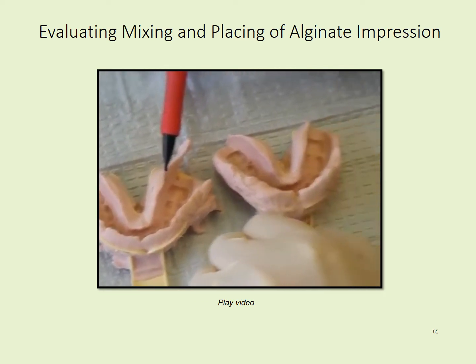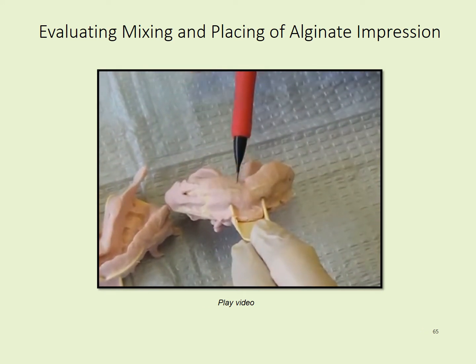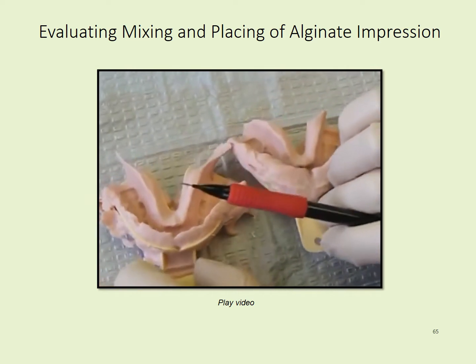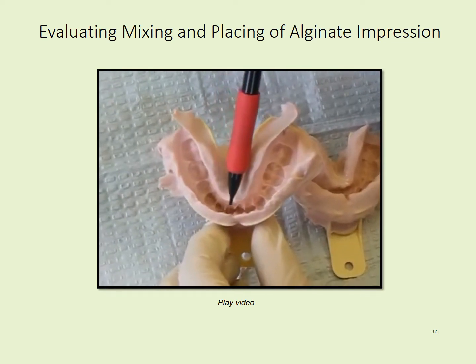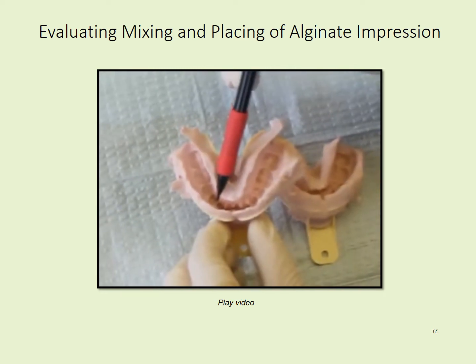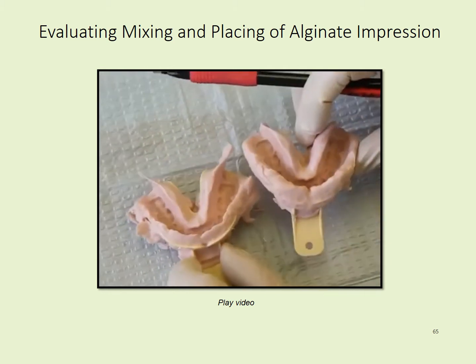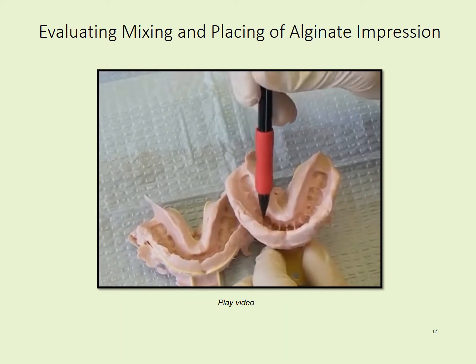On this impression, you can see that there is a small portion of the tray that's showing through, but the majority of it is covered up, and you can see there's a large rounded type of border as opposed to this sharp contrasting border right here. Let's hold this up and show you. You see how thin this is? This is thin because the alginate was thin and the muscles were pushing the material out of the way. I can move that with the end of the pencil there. You can see how thin it is, as opposed to this, to where it is larger, thicker, and more rounded. It doesn't come to a point.